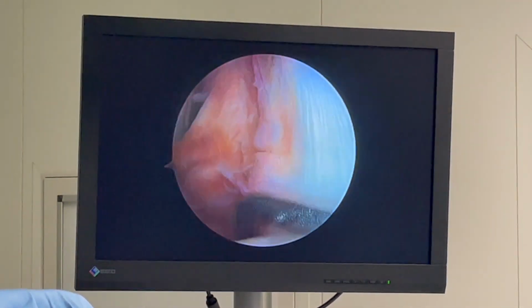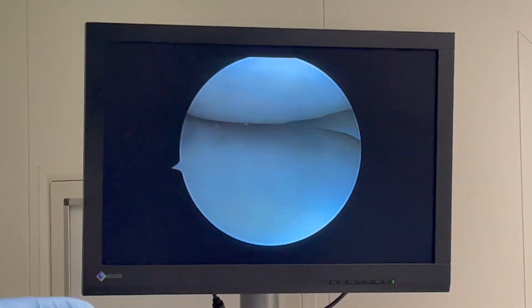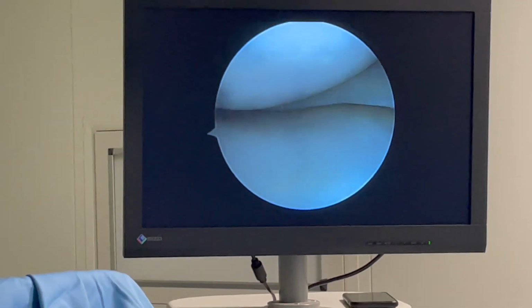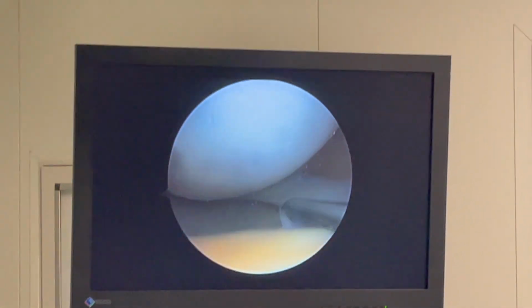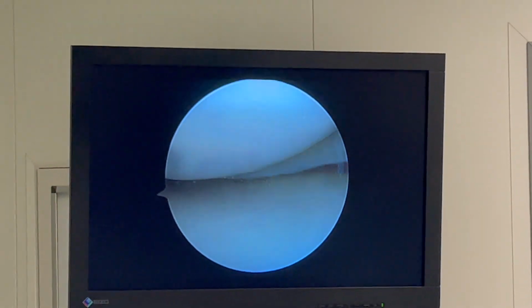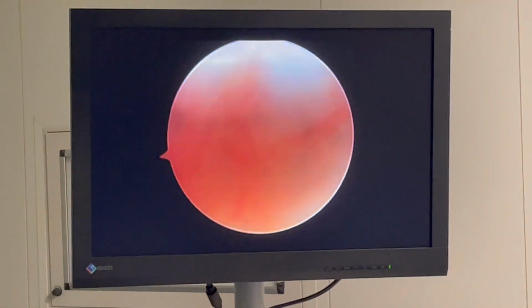So as for the medial side, we see the menisci, the medial side, the inner side is quite good, right? So this is the menisci, right? Yeah. The small cartilages. So the inner side one is good. Okay, we'll come to the outer side. MRI says there's a tear in the outer side one.